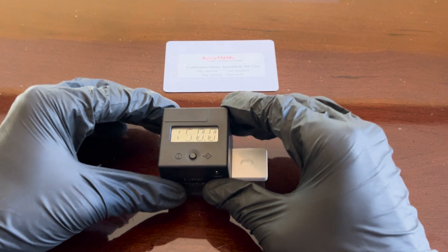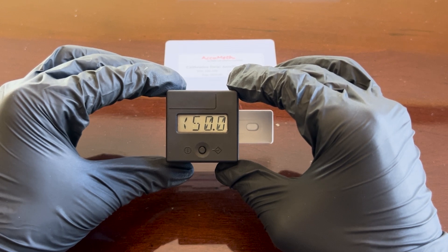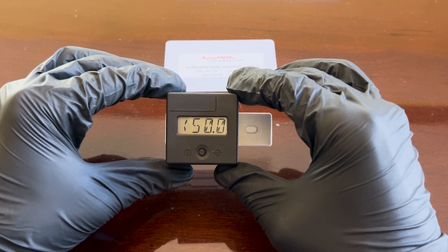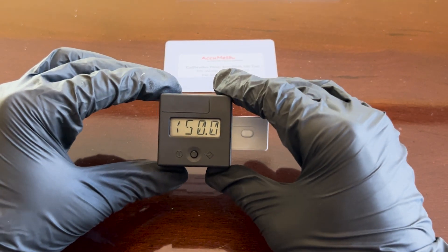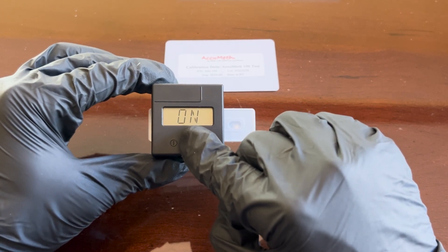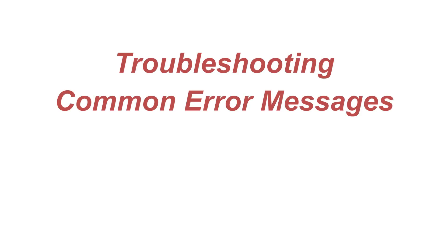The display will show the concentration of methamphetamine residue that may or may not have been detected. Here you can see our black box returns the value of less than 50 nanograms, which is below the target standard for methamphetamine residue concentration, indicating that our test can be considered negative. We can press the button again to return to the on menu where we can perform another test measurement if desired.